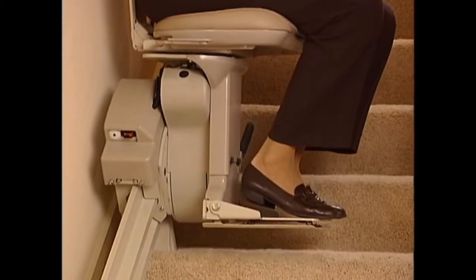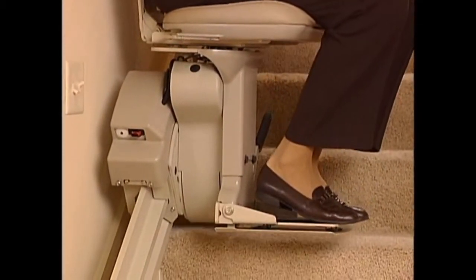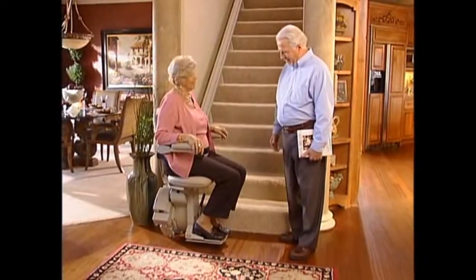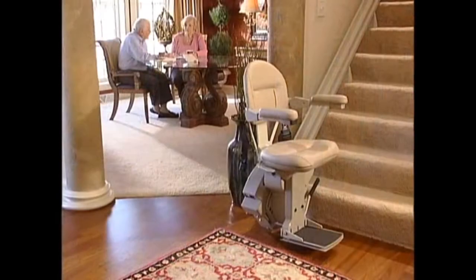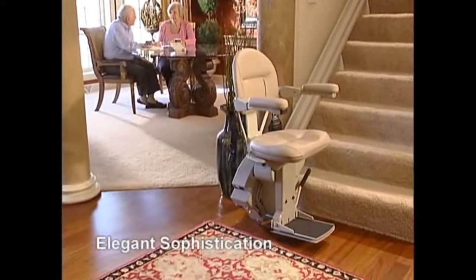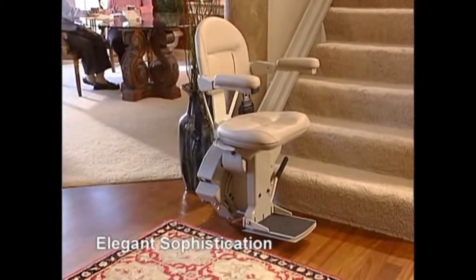With a honeycomb rail that hides all mechanical components while providing improved stability, the Elite's rack and pinion drive system delivers a luxuriously smooth ride with no hesitation when stopping or starting. No one who sees this stairlift can disagree that it's the epitome of elegance, the perfect accessibility product to reflect the taste and sophistication of the most beautiful of homes.